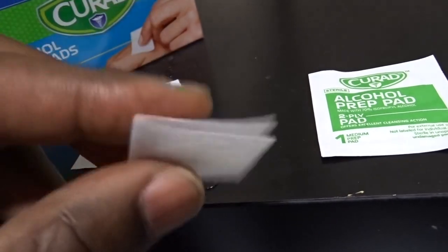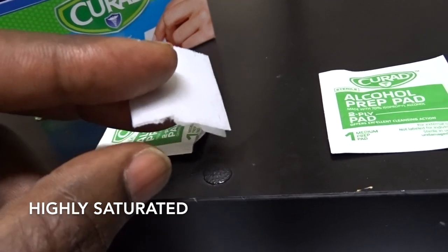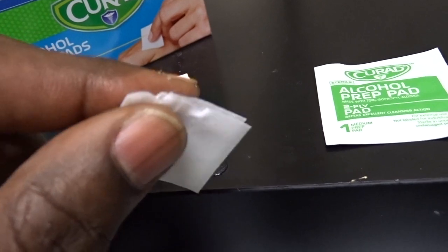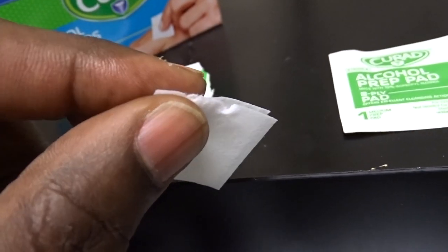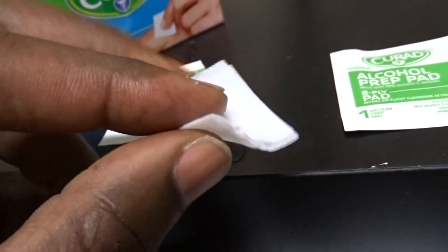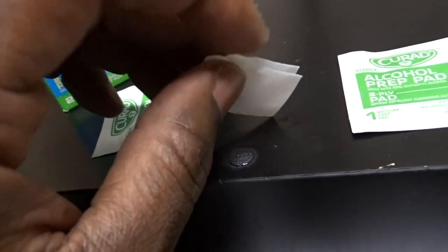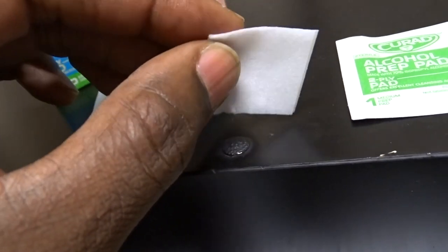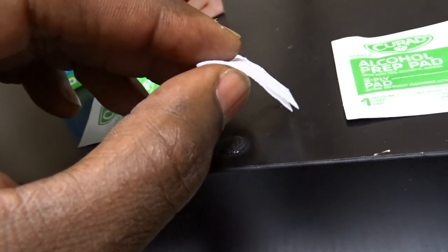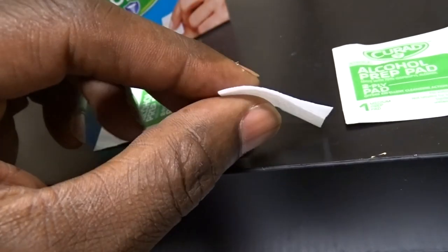These pads are saturated to a great degree with alcohol, and it cleans and sterilizes that area. If there's any bacteria around that could cause an infection, you're wiping it off so it won't be an issue when you're doing a procedure.